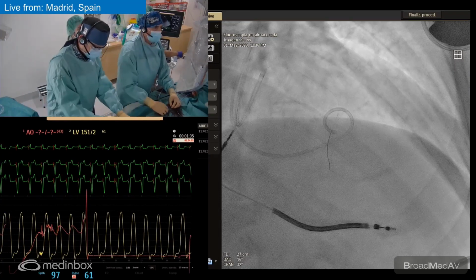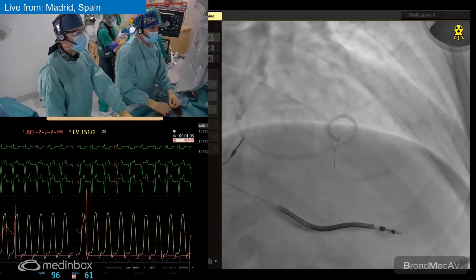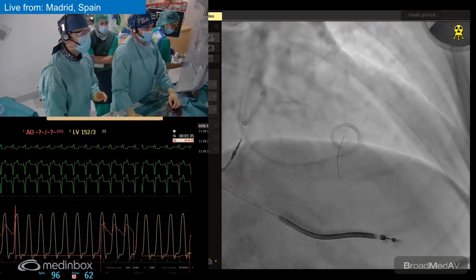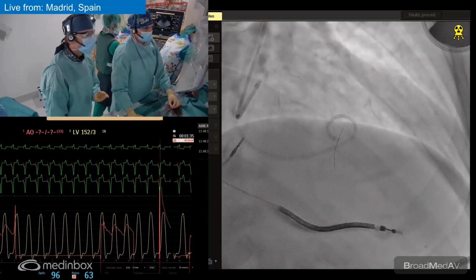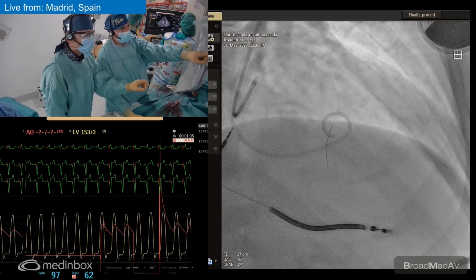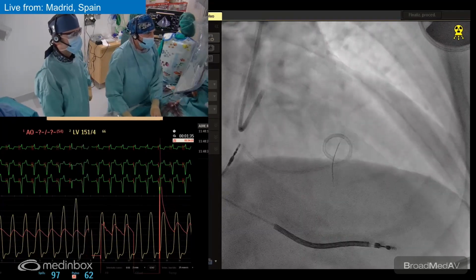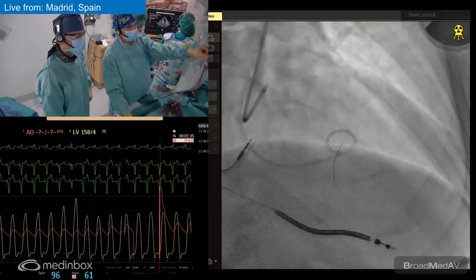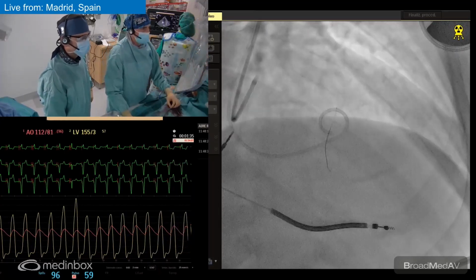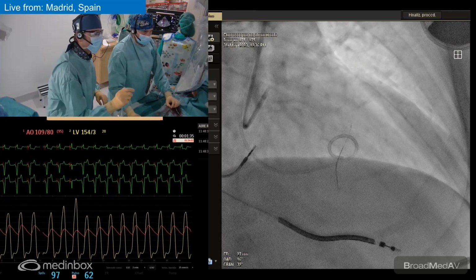Okay. So you can see the 1.5 balloon entering the septal. The marker is in the middle of the balloon, so you can probably, you are there. Maybe a little bit further. If we inflate back proximal, we can occlude the two branches. Probably. Maybe we can try. The problem is that if we are very near the LAD, when we retrieve the wire, the balloon can go up. But so I think we are going to inflate here. A second, another test, please.